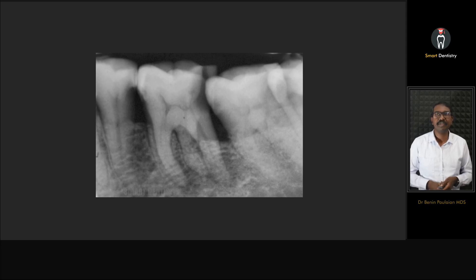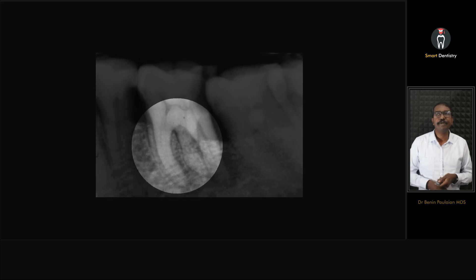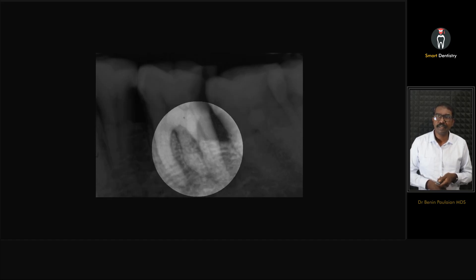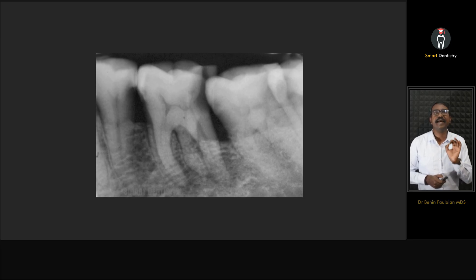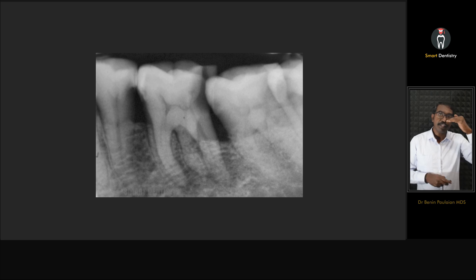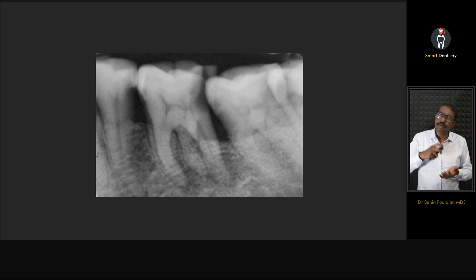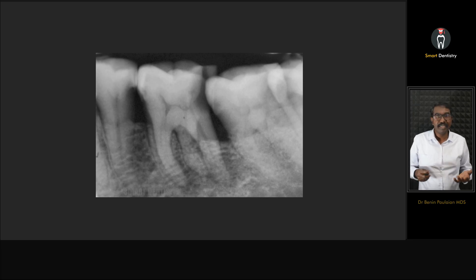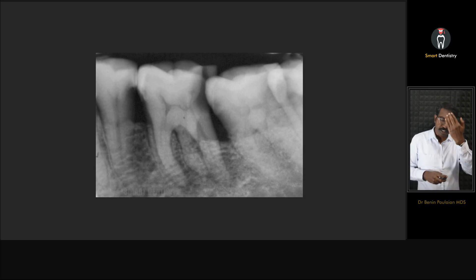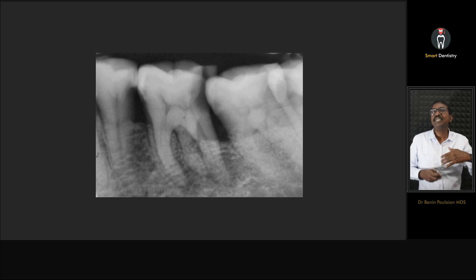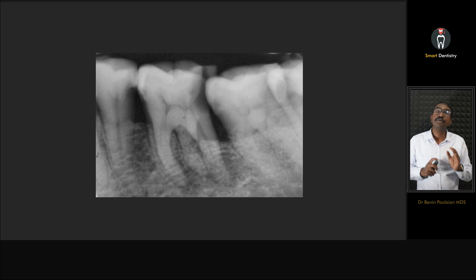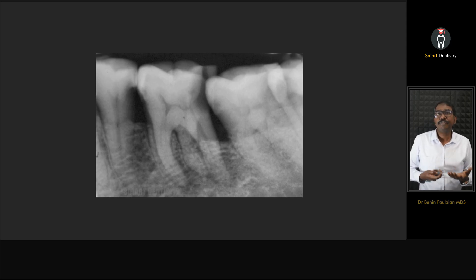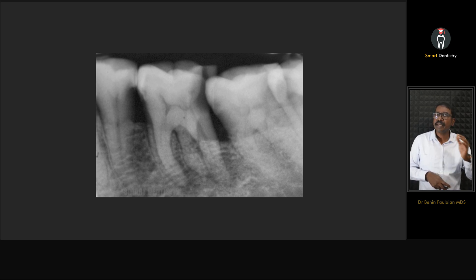Here is a simple case of my management of radix endomolaris. In the pre-operative radiograph, you can see the mesial root, the distal root, and in between you can appreciate the radix root — the extra root. Sometimes it may not be equal in length to the mesial and distal roots; it can be short or long. What we cannot appreciate on a radiograph is the angulation — it is not a straight root or canal, it will be projecting towards the lingual aspect. If you have not experienced this before, always take two pre-operative radiographs: one at a straight angulation and one with a slight mesial or distal angulation, whenever you suspect a radix root.